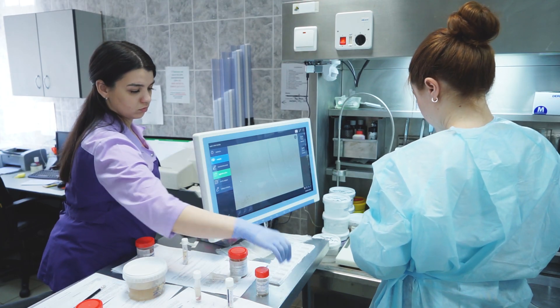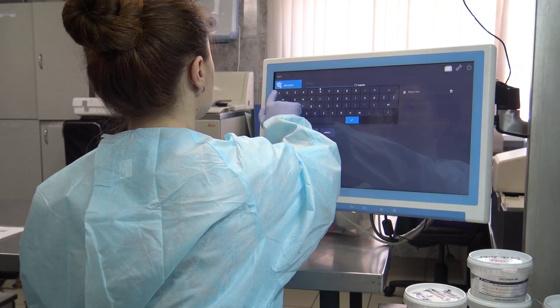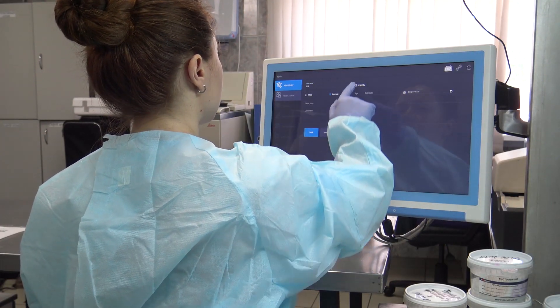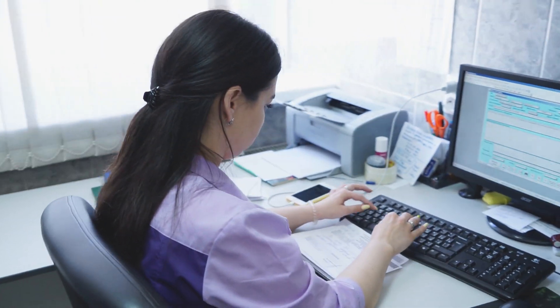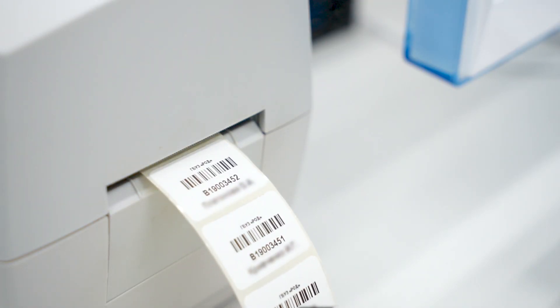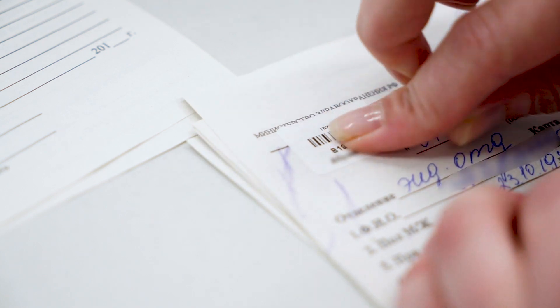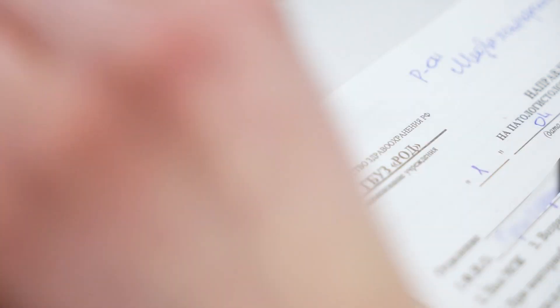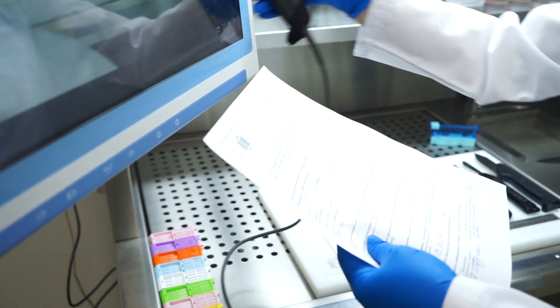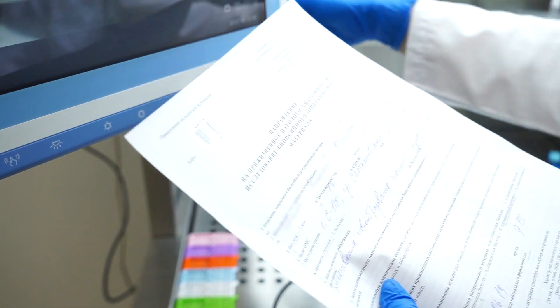Registration of the case at the ePath station takes only a couple of minutes. All information automatically loads to the electronic system. Data can also be downloaded to the system from a grossing assistance computer. If the lab has a barcode scanner, you can connect it to ePath. After scanning the barcode on the medical referral, the case opens automatically.